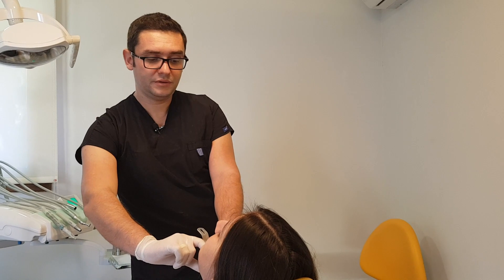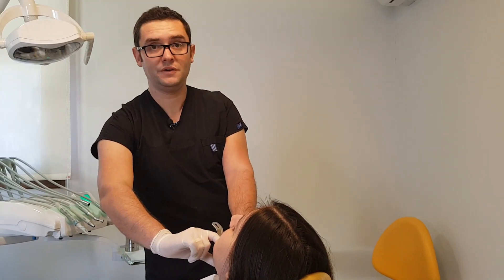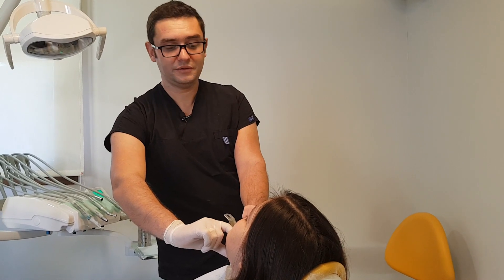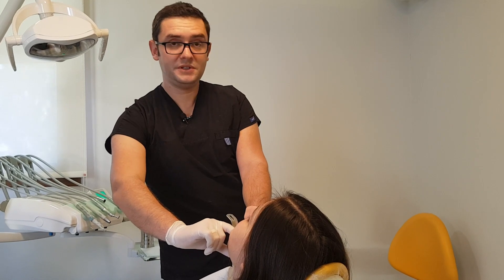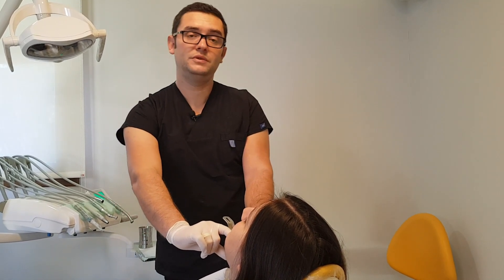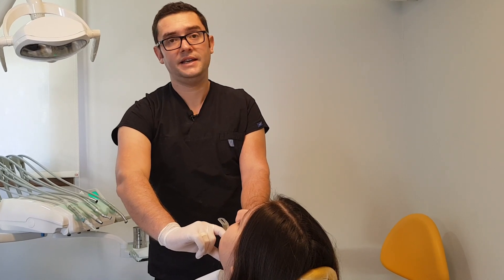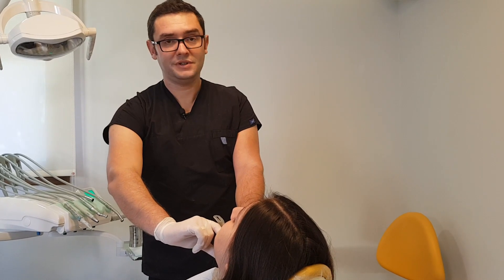Some people cannot even stand for 10 seconds. We try to change their mind — we want them to count inside, put one leg up, then the other, to make them not focus on this procedure. But still it is very difficult. And when we remove the impression tray from the mouth, we see that the impression is not good enough.